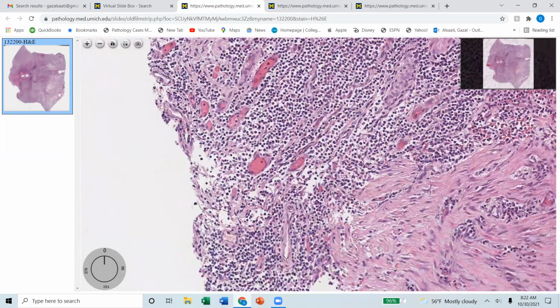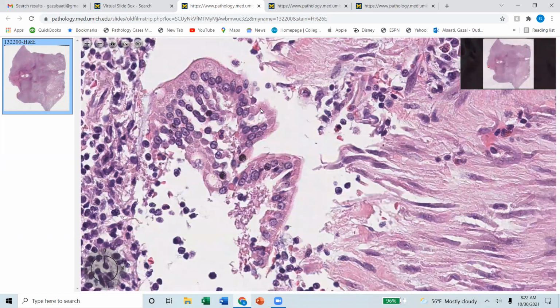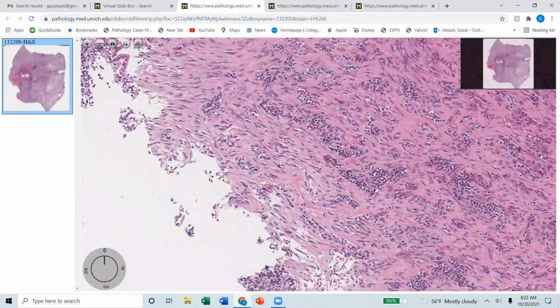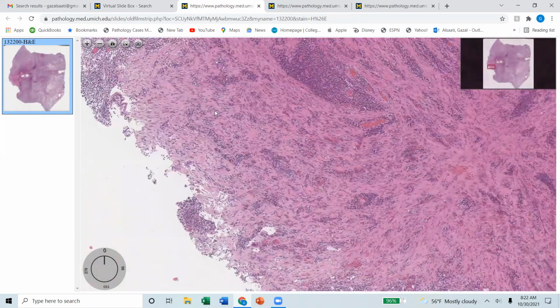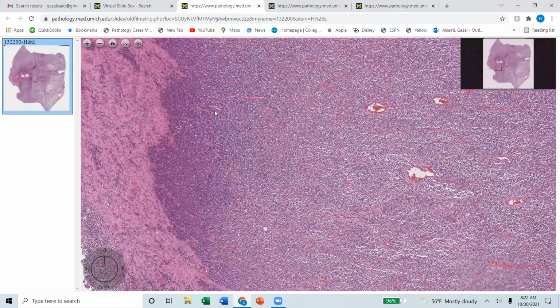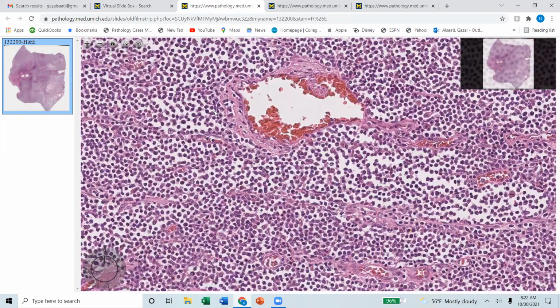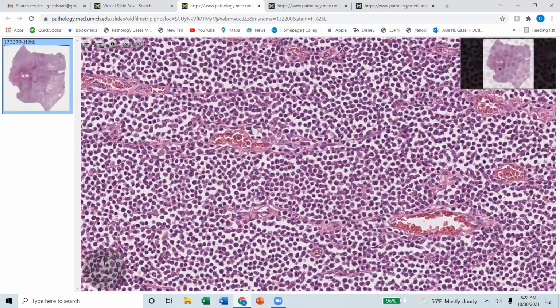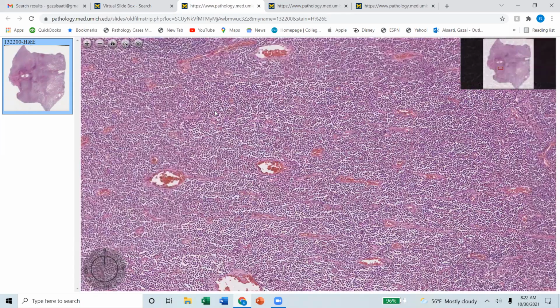Just like you see in celiac disease and microscopic colitis, you'll see a lot of lymphocytes in there. Here, this is a small fragment of epithelium, and you'll see them like here, just like celiac. Then you will see a lot of them, like a lymphocytic colitis picture. Yes, exactly. Usually the cases that I have seen are like this. They are big, and there's a lot of sloughing of the epithelium too. But whatever you see are the monomorphic cells.